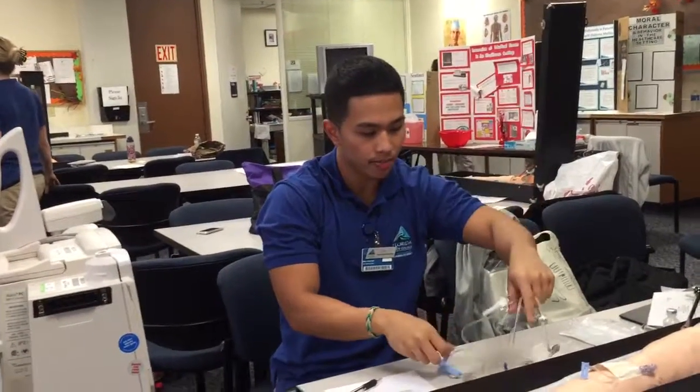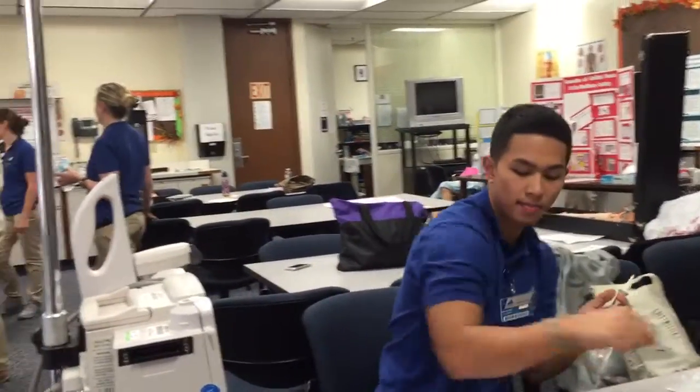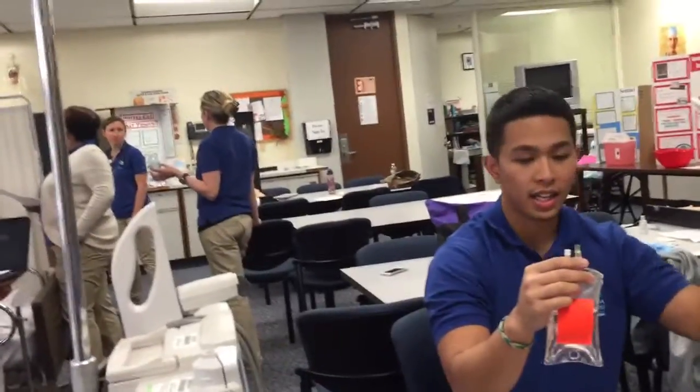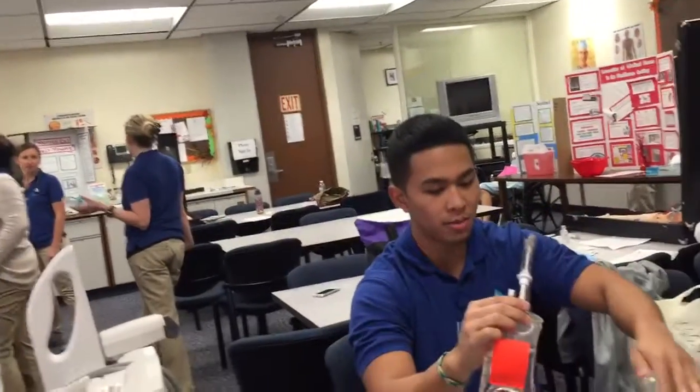So this is good to go. I'm going to go ahead and take this off, dispose of that, and it's going to go into this end right here, the blue end, so I'm going to take that off. And then I'm going to go ahead and spike that, which it has already been spiked, but I'm going to go ahead and do it again. All my clamps are closed so it doesn't run out.